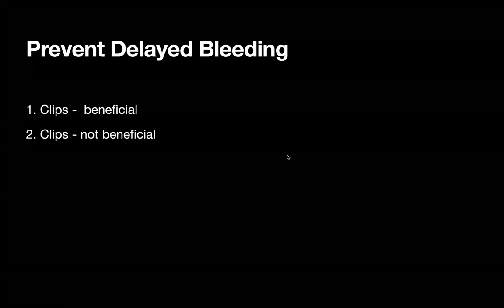But other than this, then you would close. What I meant with the deeper cut is that if there is any evidence of a deeper cut at any part of the resection, then you will focus on that area with making sure that the closure is complete.